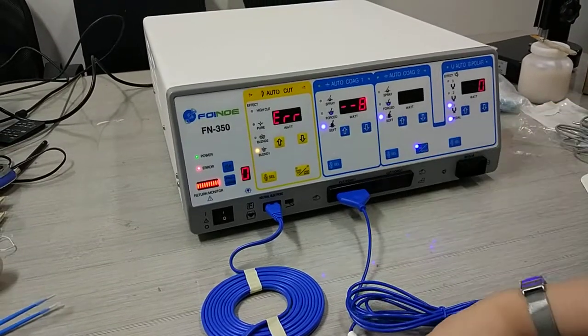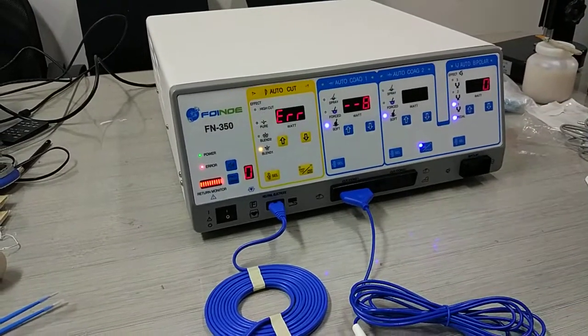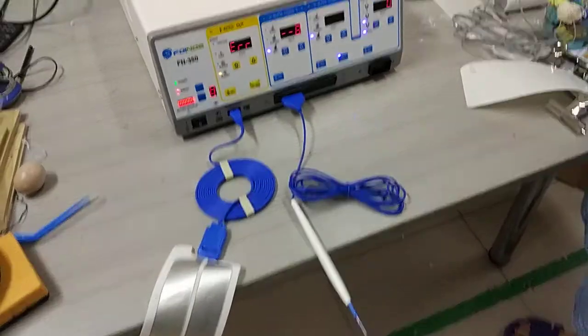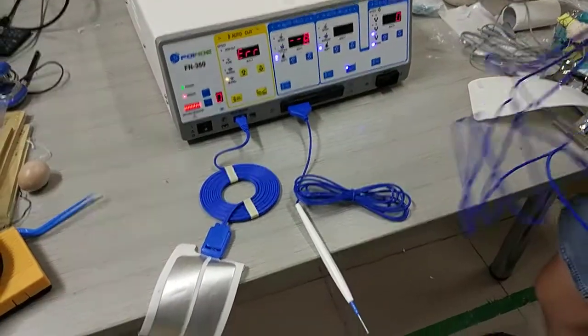For this machine, we've got two pencil connections.